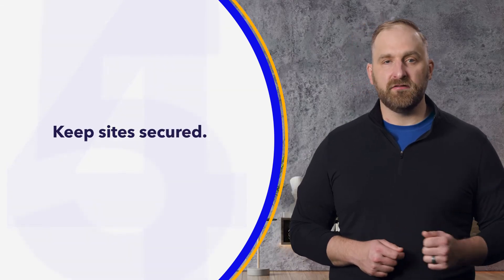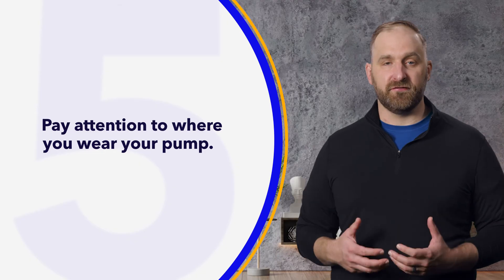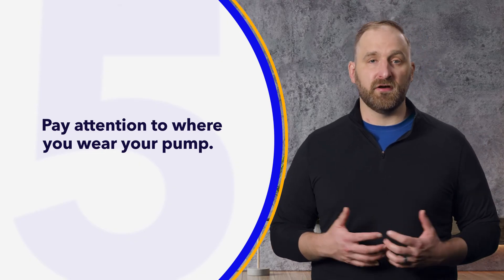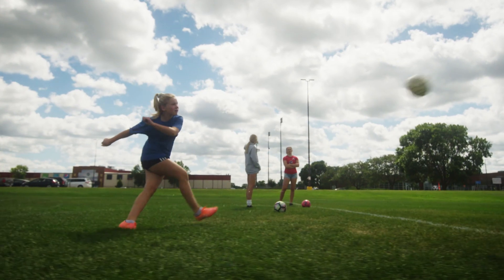And last but not least, pay attention to where you wear your pump. Depending on the type of exercise, consider clipping your pump into a different location. Many clothing brands have options with pockets for cell phones, which double as great pump pockets. Activity belts are another great option. I hope you find these tips helpful. Now get out there, champ!